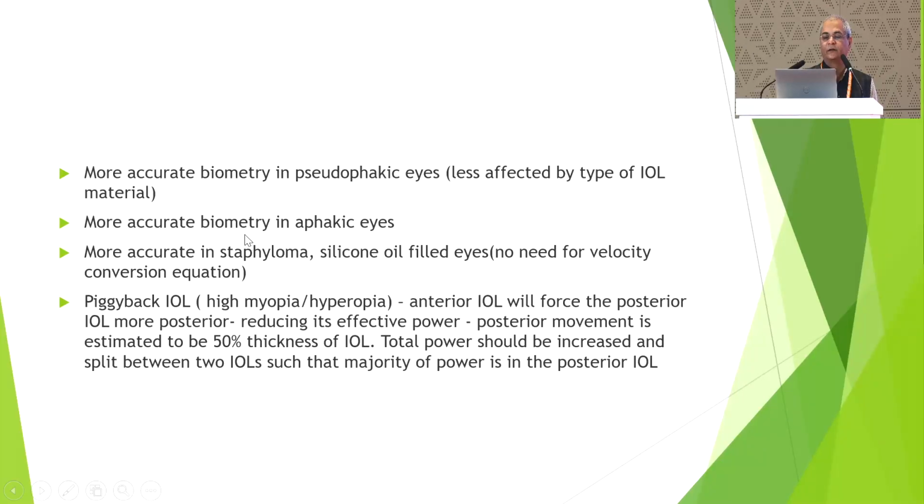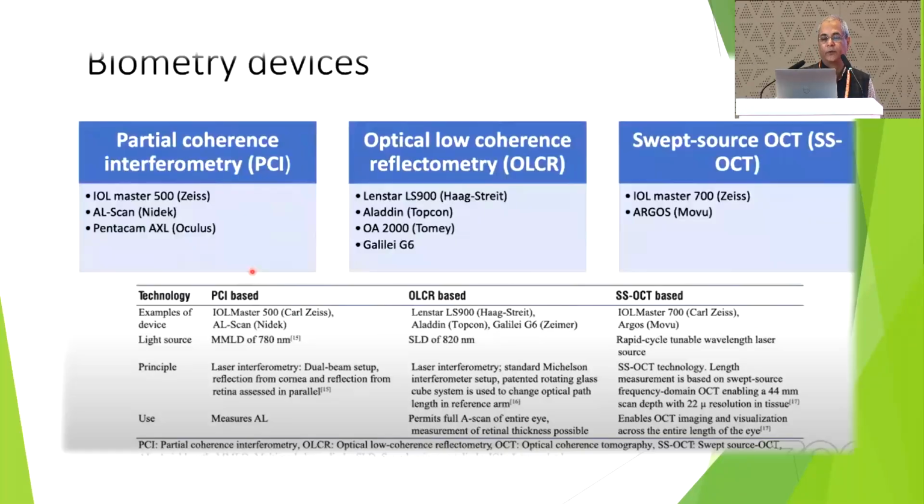So these are the few things in pseudophakic, aphakic, staphylomas, silicon oil. In these, you have to do adjustment in the ultrasound biometer, while optical will be taking without this. So definitely optical will be better in that.